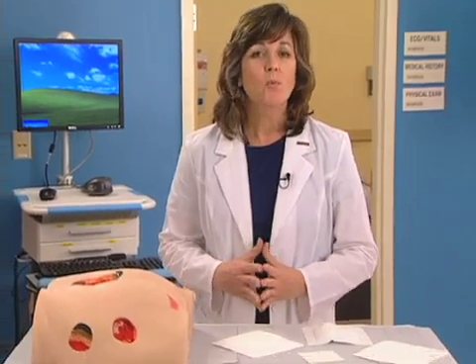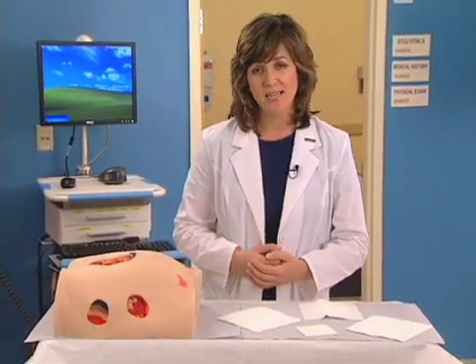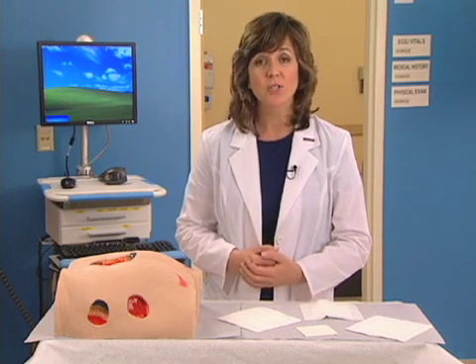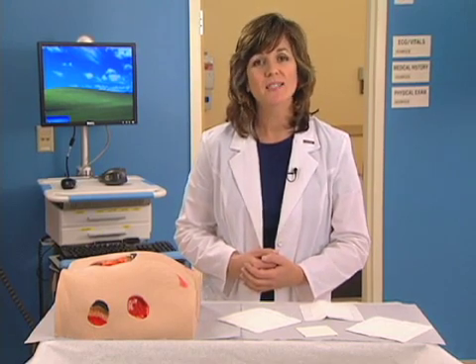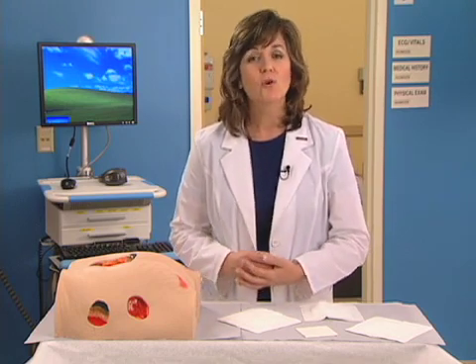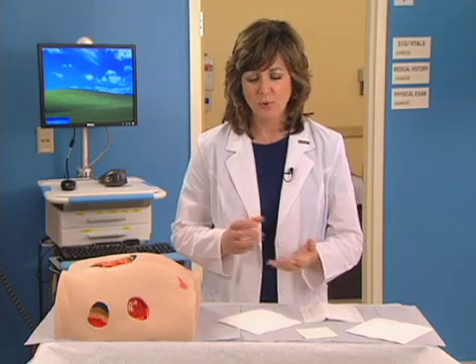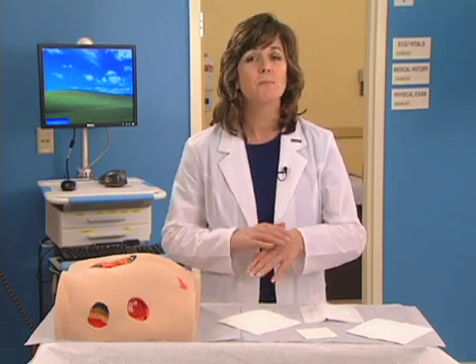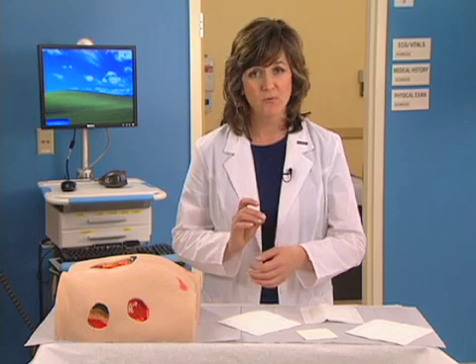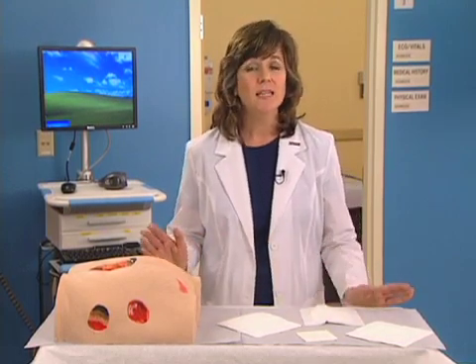They help maintain a moist wound environment and offer a barrier to bacteria and other contaminants, while their waterproof nature makes them a popular choice for areas affected by incontinence. Many composite dressings incorporate an adhesive border of non-woven fabric tape or transparent film for simple Band-Aid type application and removal. Most, although not all, composite dressings have 3 layers.